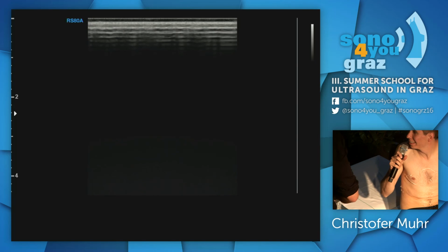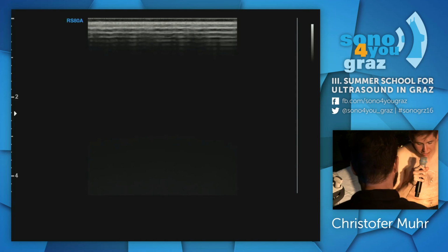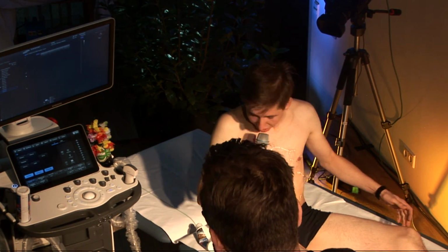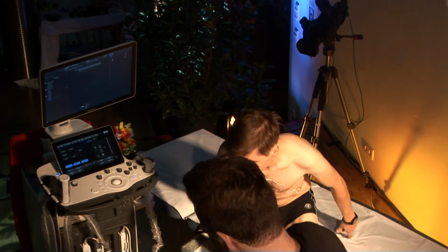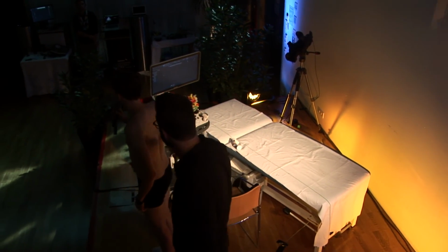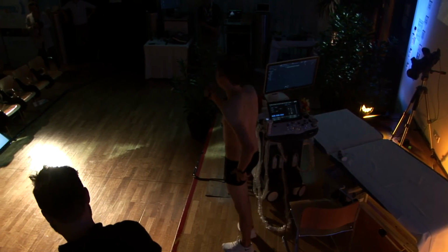Thanks a lot. I think that summed it up really well, what we're doing with RUSH. And this is how they should look afterwards. Yeah, just so you can all see. Well, yeah, the back is fine actually, but the front is pretty much fully covered.